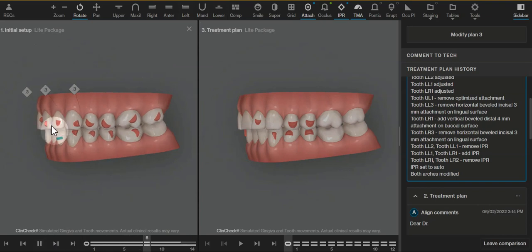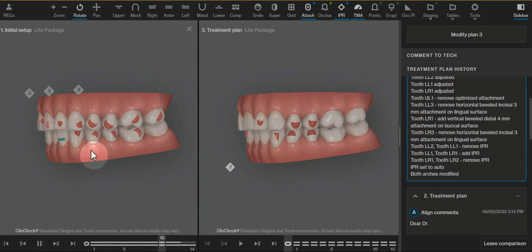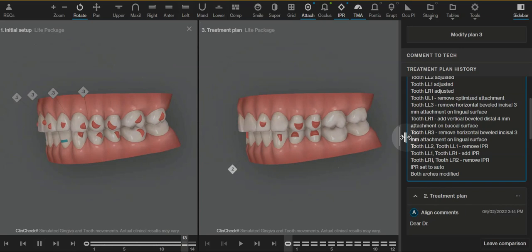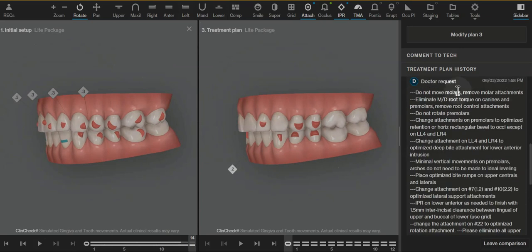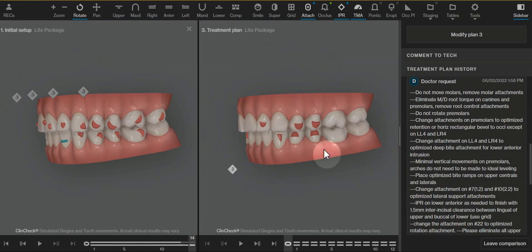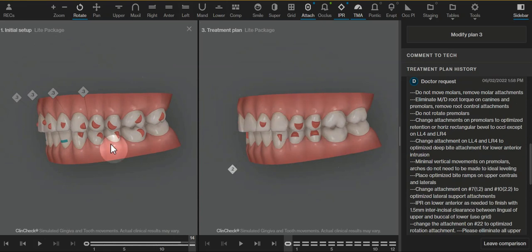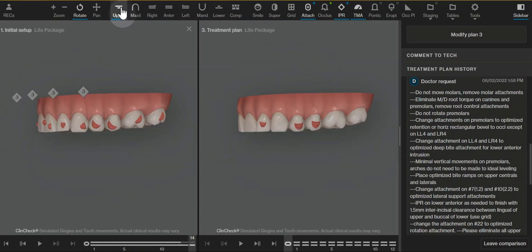You can see many of the comments that I made to get to a much cleaner clincheck. No molar movements, and then eliminated a lot of the rotation and root control movements in order to get this into a place where we can just use retention attachments.